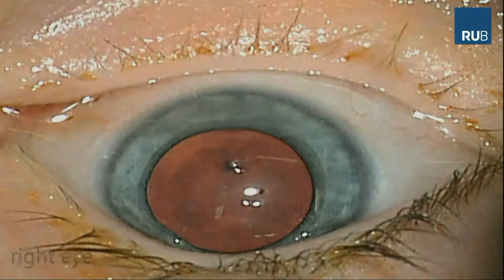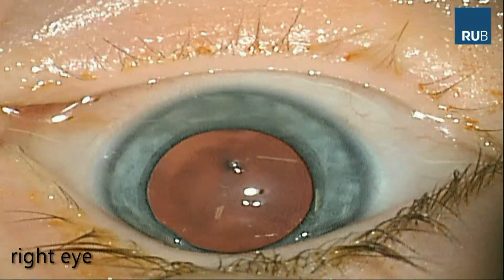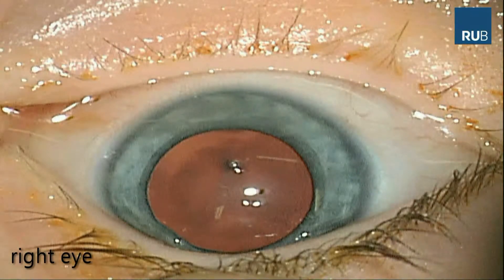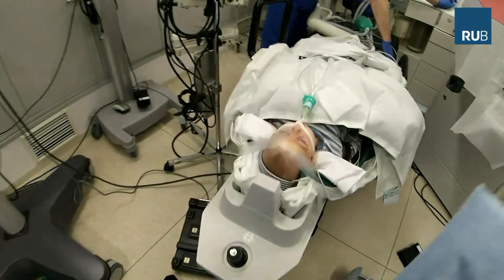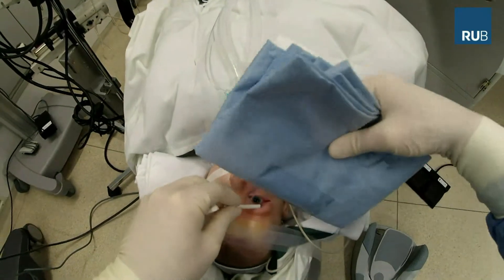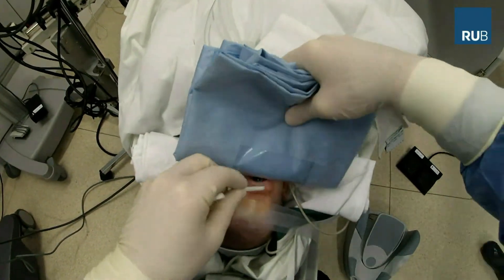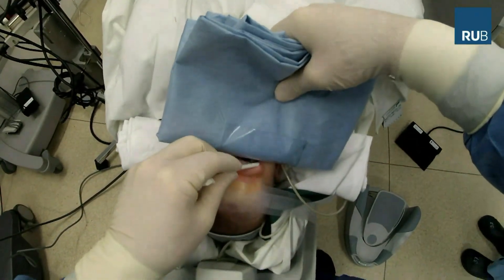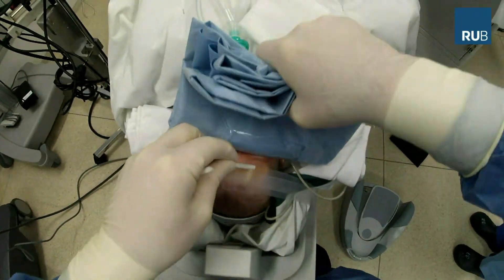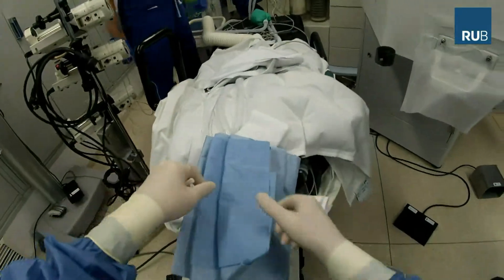This patient is a four-month-old male with bilateral cataracts where we conduct a femtosecond laser capsulotomy procedure of the anterior and the posterior capsule in the right eye. A lateral canthotomy was performed beforehand.